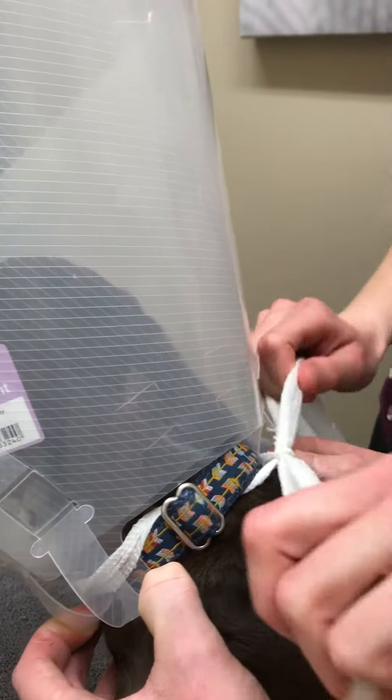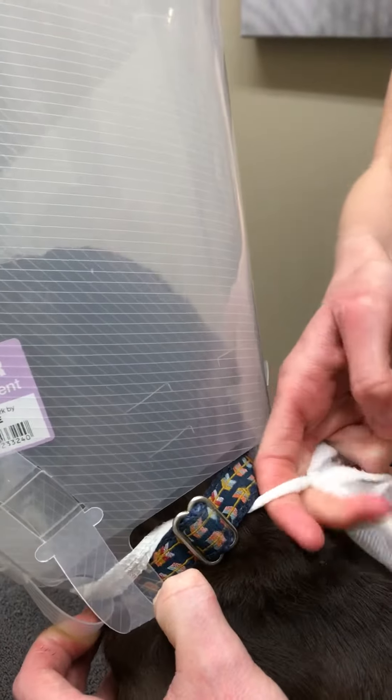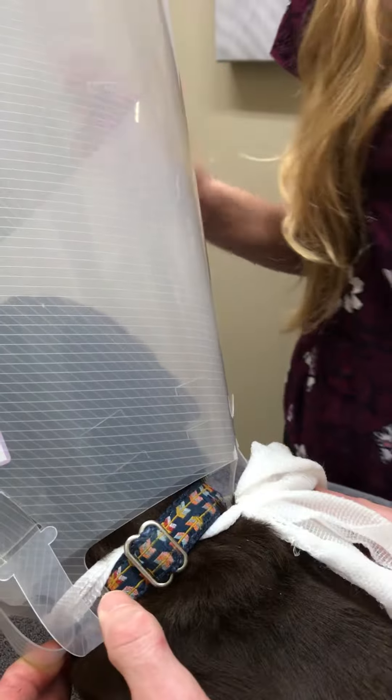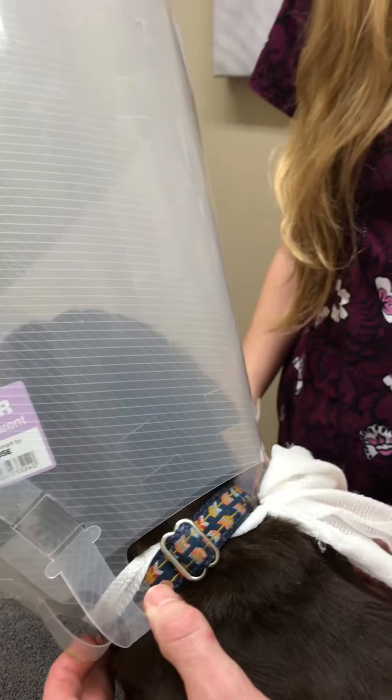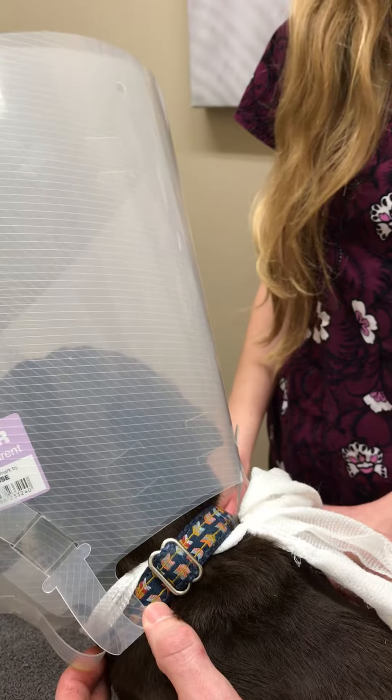And we can tie that up into a bow there. Again, after it's on and secure, always make sure two fingers fit around the entire thing, just to make sure that it's not too tight. That should be secure on there, and hopefully we will be leaving that on for as long as the veterinarian has recommended.